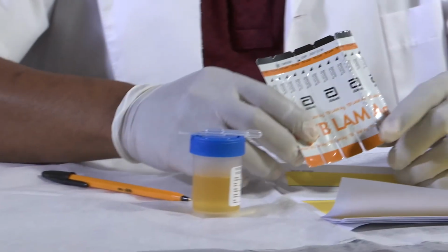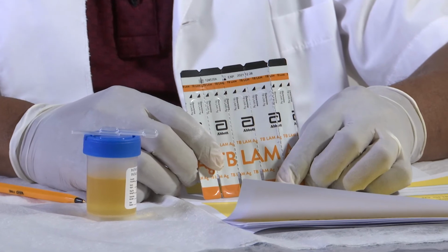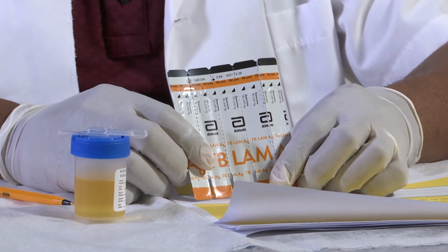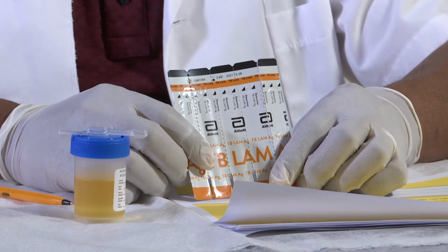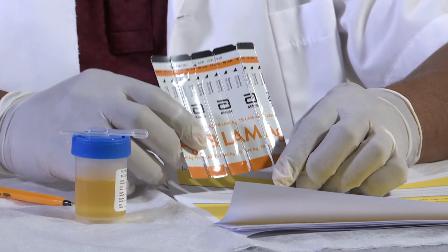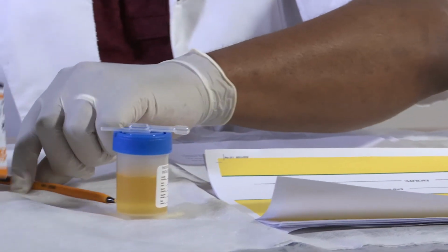Test station has now been prepared and we have ensured that all materials are available and neatly set out. Check the condition of the test kit and strips. Record the kit lot number in the remarks column of the TB ID register. Confirm the expiry date and storage conditions of the kit.